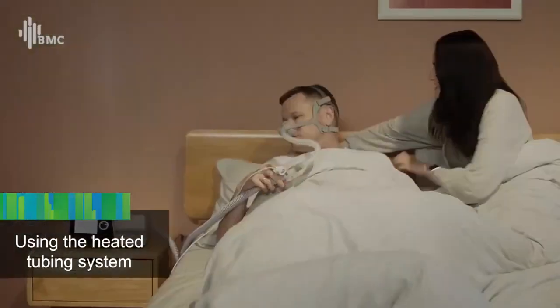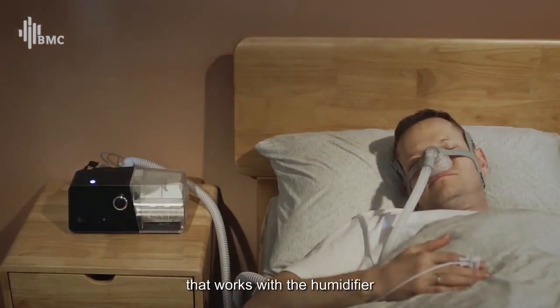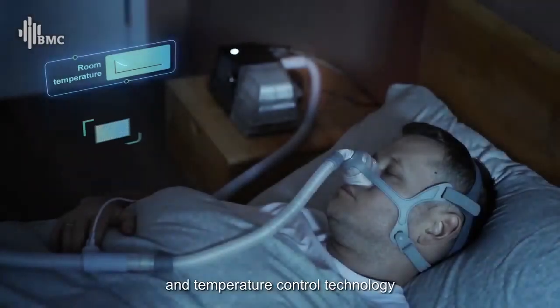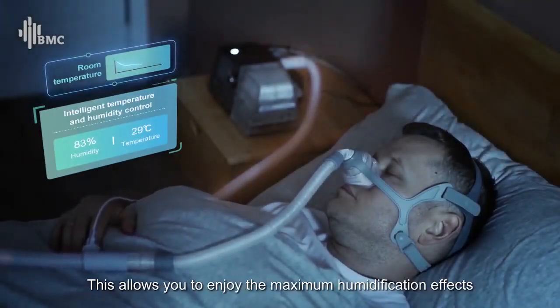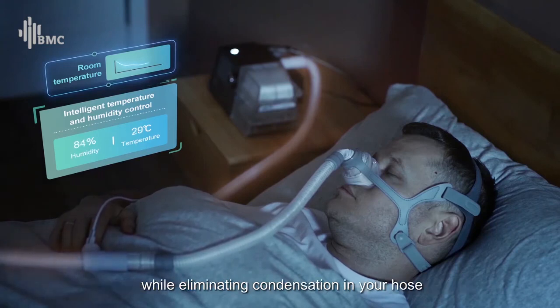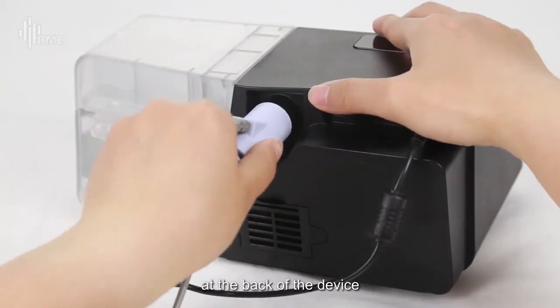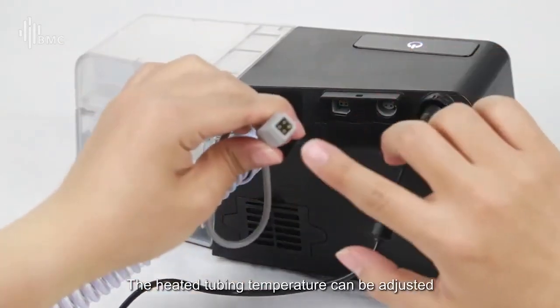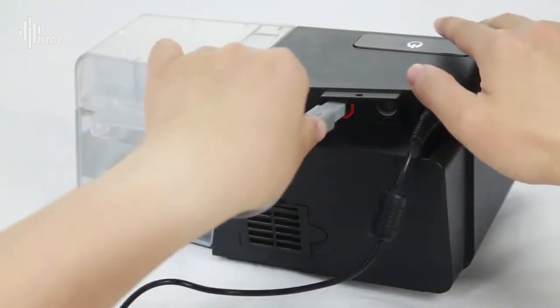Using the heated tubing system. The G3 can be equipped with a heated hose that works with the humidifier and BMC's intelligent automatic humidification and temperature control technology. This allows you to enjoy the maximum humidification effects while eliminating condensation in your hose. Connect the end of the hose to the power supply connector at the back of the device. Connect the other end of the tubing to the mask. The heated tubing temperature can be adjusted in the settings of the G3.